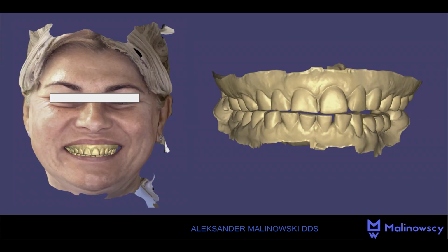Okay. On this slide, you can see the registration of occlusion in the position of neuromuscular equilibrium, or the central relation. As in the previous case, we achieved this by deprogramming the patient with the composite attached to the incisor teeth of the maxilla. The patient should be deprogrammed so that the height of the deprogrammer is close to the expected height of the prosthetic work.